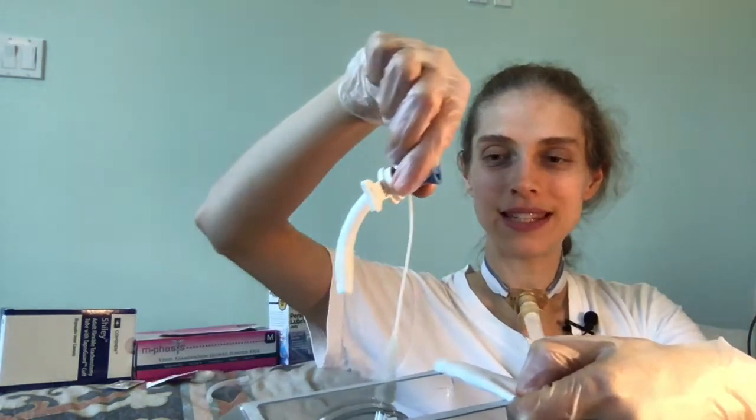Once you've done this, now you're gonna wanna go with your clean hand, and don't try to touch anything else. You're gonna wanna carefully pick up your tracheostomy tube right here, right at this end. And then once you have this, you're going to want to insert the tracheostomy tube at an angle. You're not gonna put it straight in like this. You're gonna keep it turned like this on an angle.